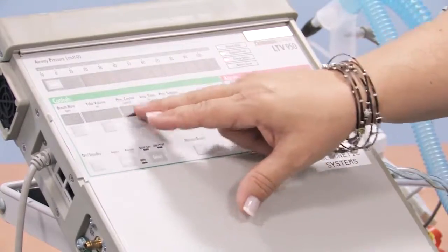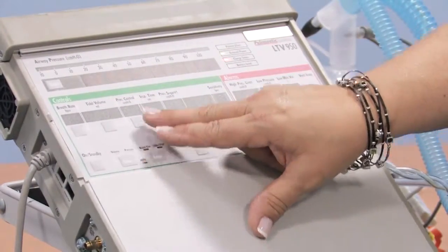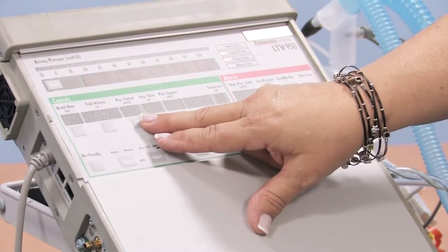So one of these two will be lit, but not both. If your child is prescribed for a pressure breath, pressure control will be lit at the prescribed number.